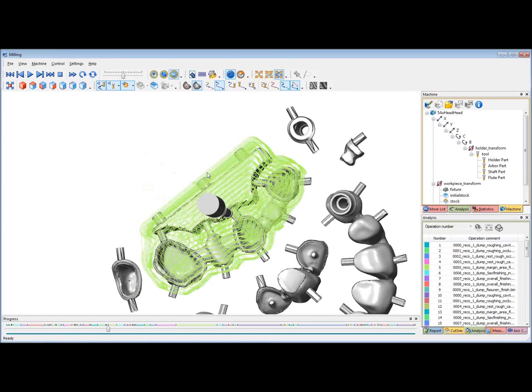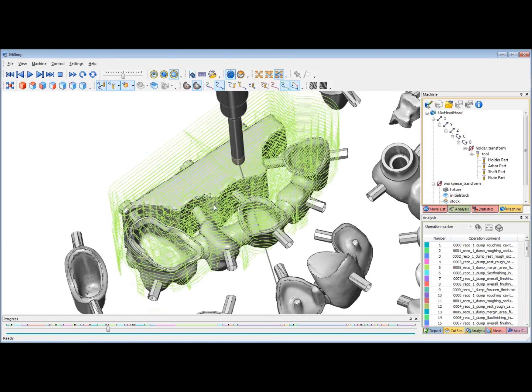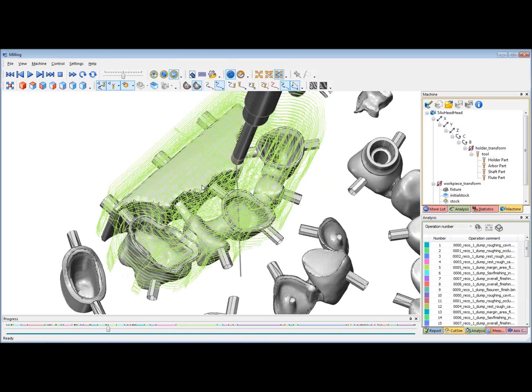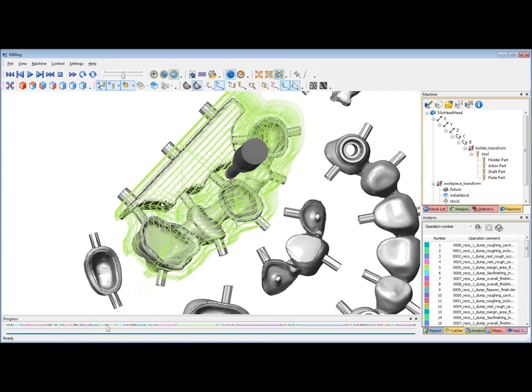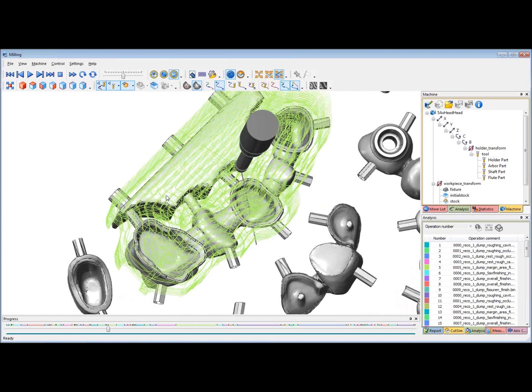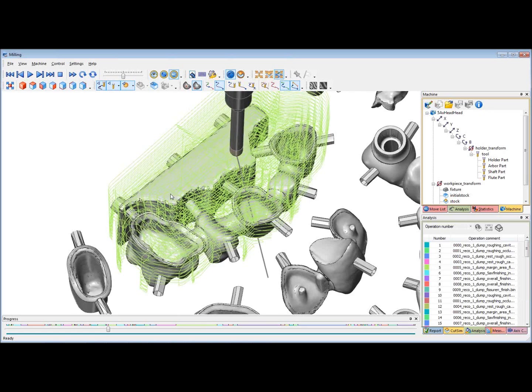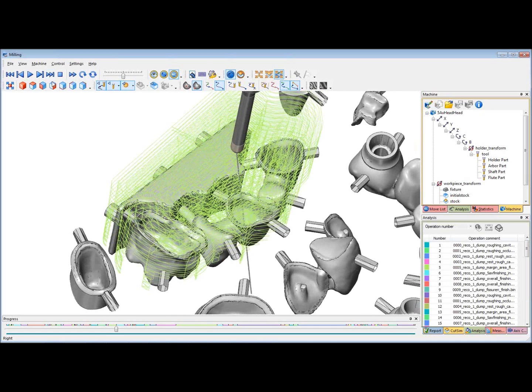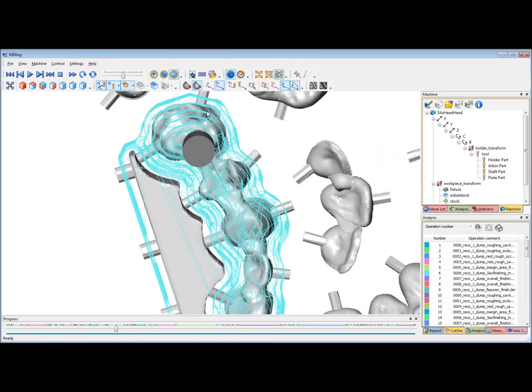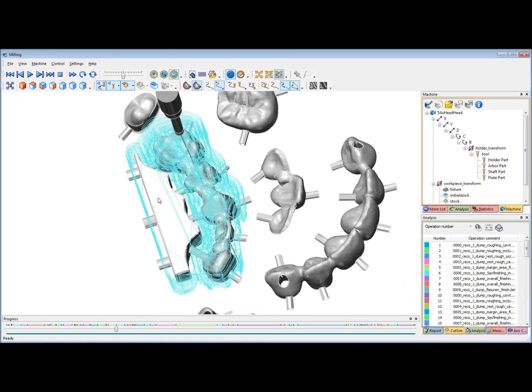Next we have a 5-unit bridge. In zirconia, sometimes we need a stabilizer for sintering. So this bridge here, we have it along with the stabilizer. On the cavity side, we are roughing the stabilizer region also, but on the occlusal side, we'll leave out the stabilizer so that during the sintering, it can rest on the stabilizer.